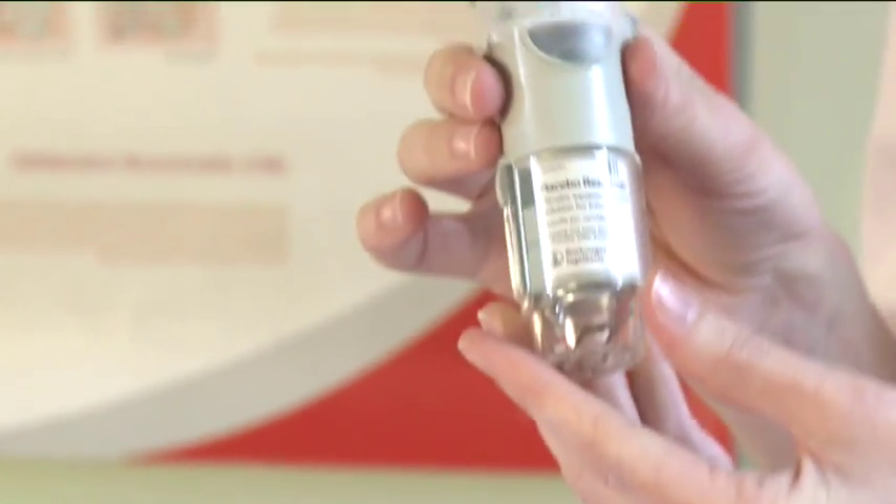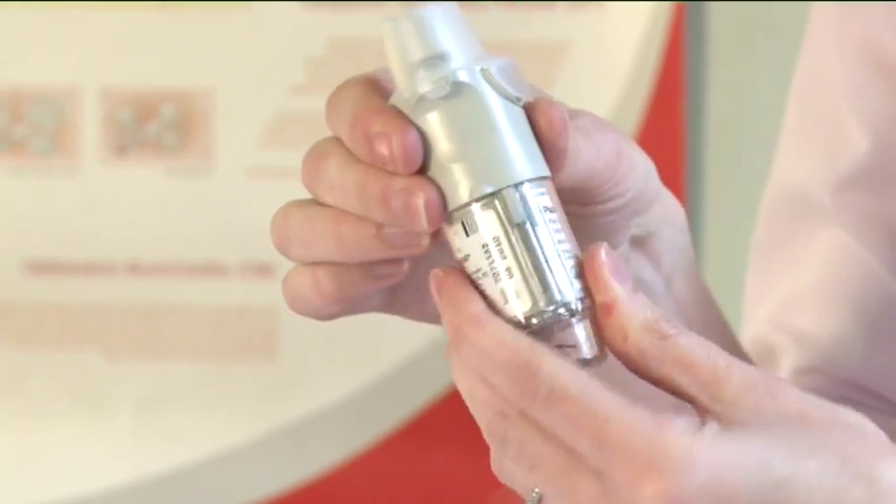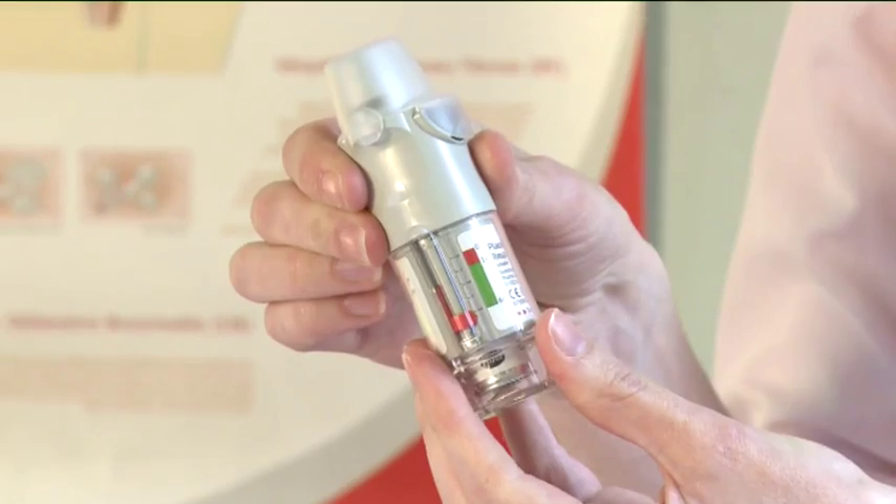To take a dose, hold the Respimat inhaler upright with the transparent cap closed to avoid accidental release of dose. Turn the clear base in the direction of the red arrows on the label until it clicks. Open the transparent cap until it snaps fully open.